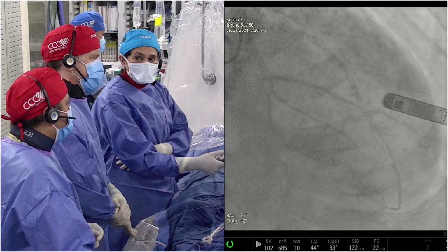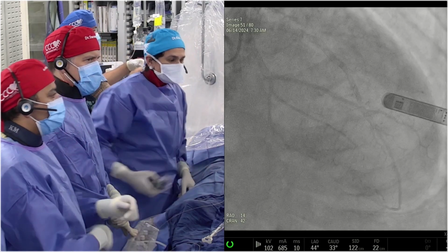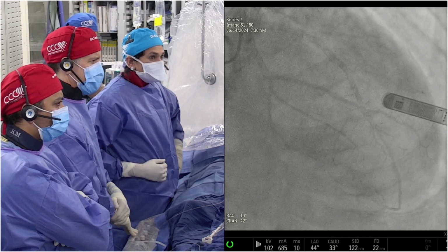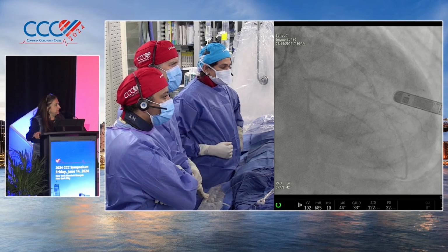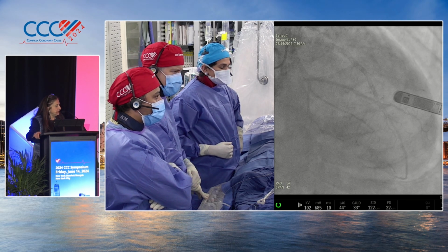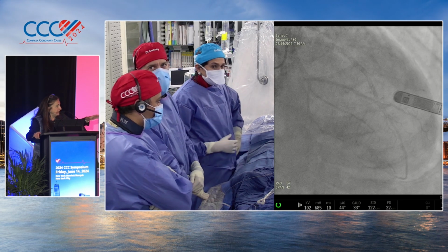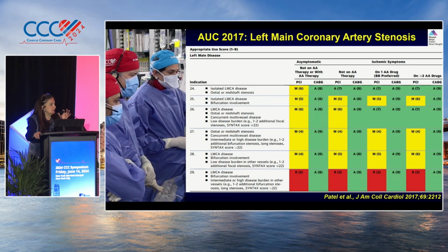So we have a fantastic panel here. That aortic valve, to me, on echo looked a lot worse than what you're telling me. I hardly saw any opening of that aortic valve, and I get really concerned. John LaSala, you're here on the panel. That's the first thing I'm thinking about in terms of proceeding without intervening on that valve. What do you think? Yeah, I'm concerned as well. I share that same concern.